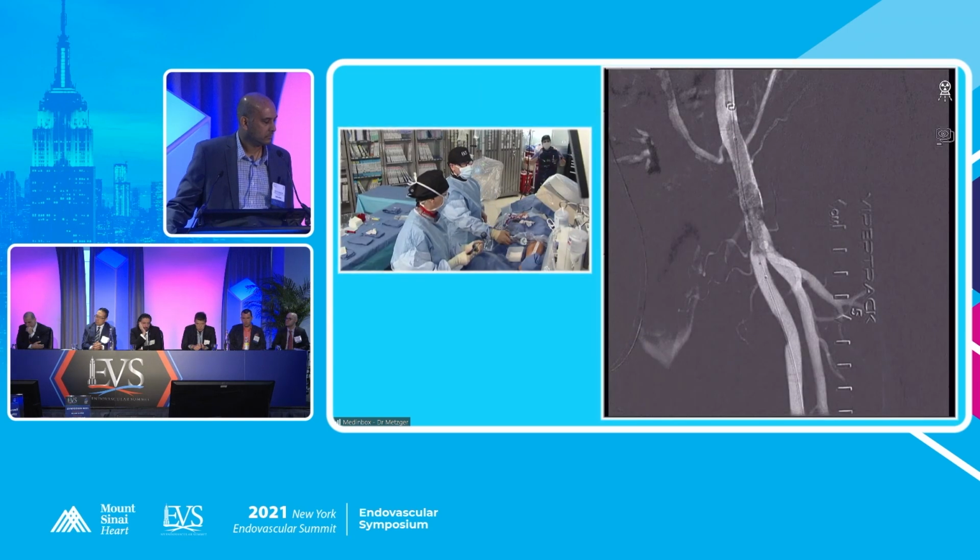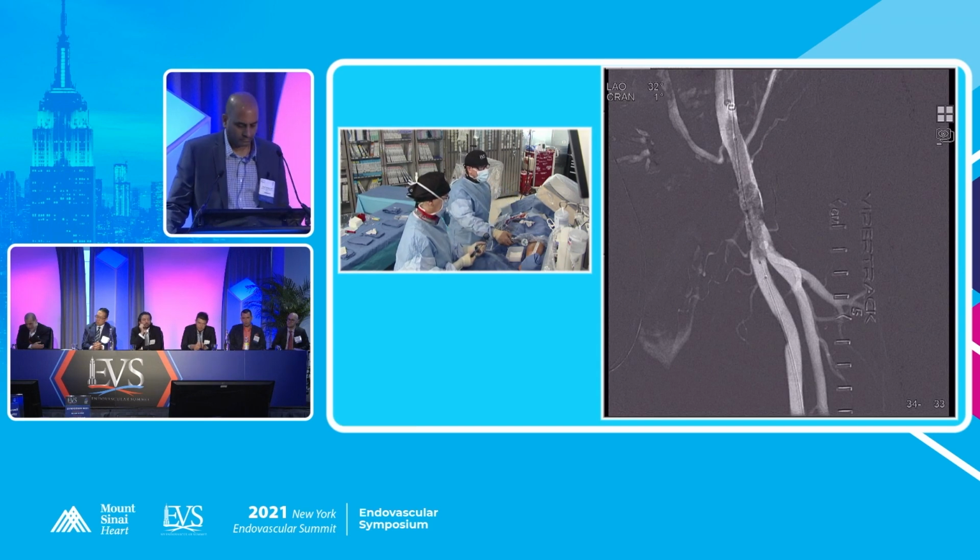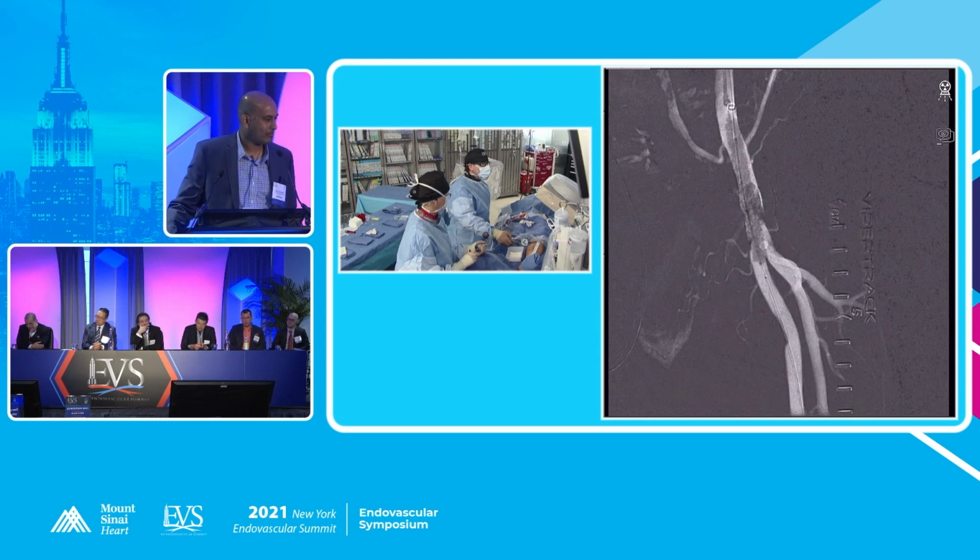Chris, you treated the right common femoral on this patient already, so you probably have a hint as to how it responded to therapy, right? That's a great point. And by the way, in this one, the other thing that's important, folks, is that you can see some on the roadmap, but remember we did IVUS on this as well. Go to 4. There was no disease into the origin of the profunda or the origin of the SFA, and it's a pretty big vessel.